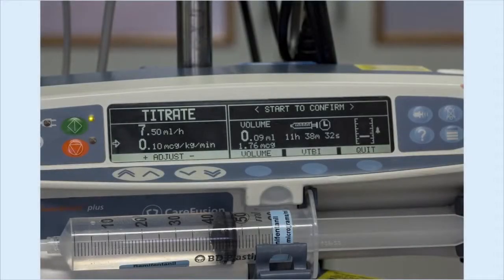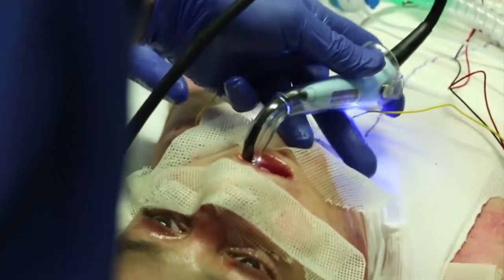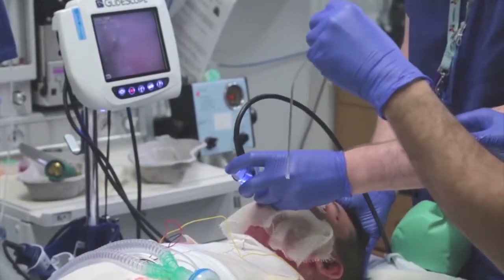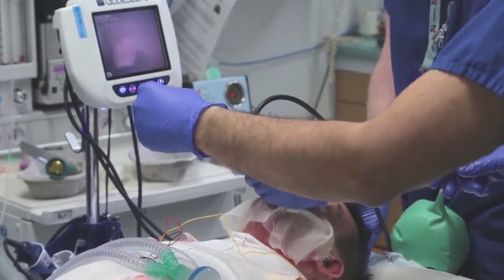Remifentanil is a potent, short-acting opioid which is useful when you wish to achieve excellent analgesia during surgery, but aim for a rapid awakening when surgery is completed. Here it is also being used to attenuate the cough reflex whilst intubating the patient who is self-ventilating in oxygen and sevoflurane.